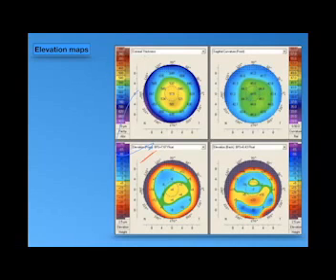It's an imaginary line from one pole of the cornea to the other one, and so the point of the back of cornea in front of it is expressed by plus, and the point back to it is expressed by minus. So there is protrusion or recession back. Okay, this is the best fit sphere.